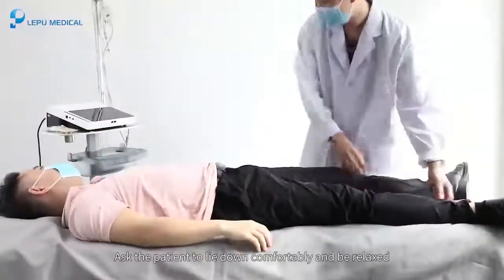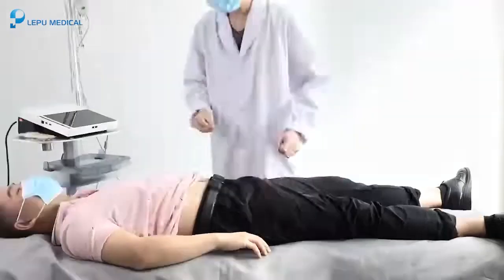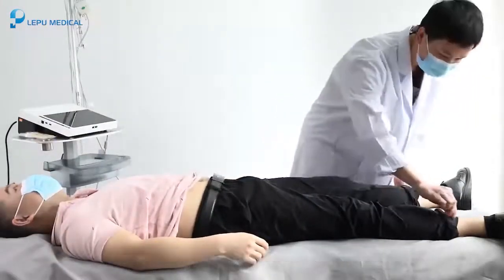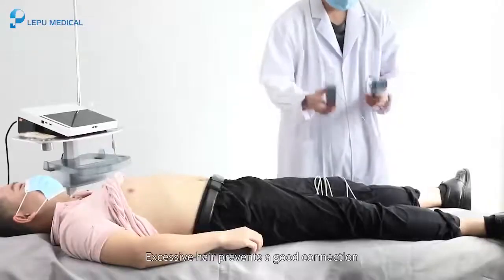Ask the patient to lie down comfortably and be relaxed. Remove the clothing from the patient where the electrodes are placed. Clean the skin where the electrodes are placed with alcohol. Shave hair from electrode sites, if necessary. Excessive hair prevents a good connection.